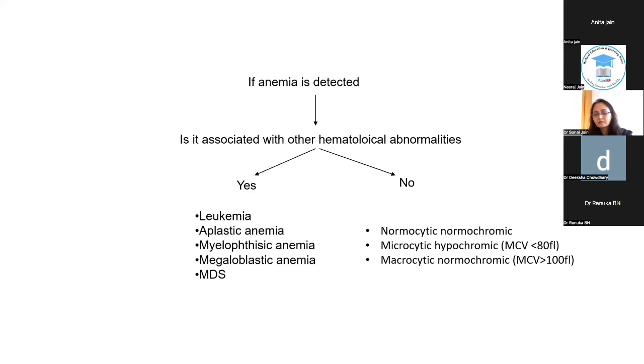But in practice, a lot of patients have a normal MCV but a wide RDW, which I'll be discussing in some of the cases in my presentation. So none are in black and white. What we see in practice is commonly multifactorial, and we have to approach it in that manner. That's why smear examination becomes very important, because what the counter gives us is an average of those millions of red cells. But what we need to tell the patient or the clinician is from the spectrum of cells that we see on the slide.